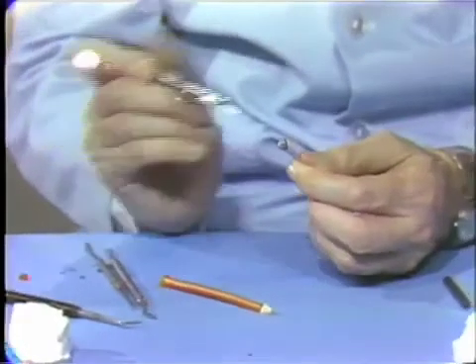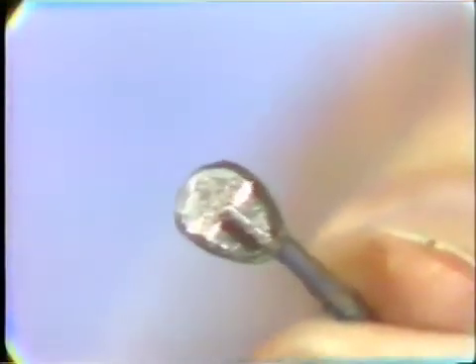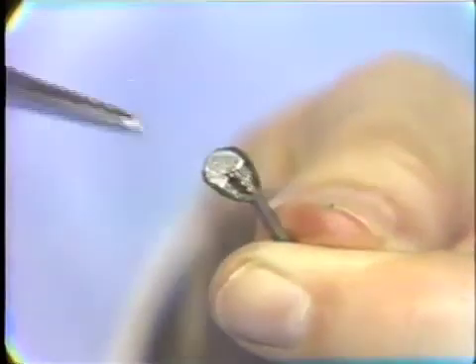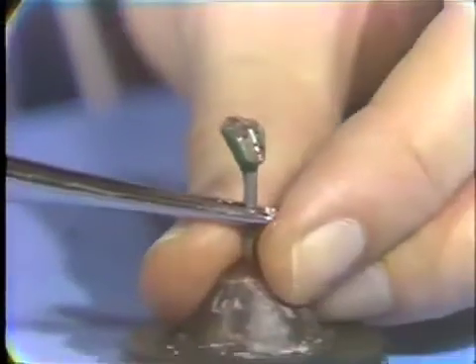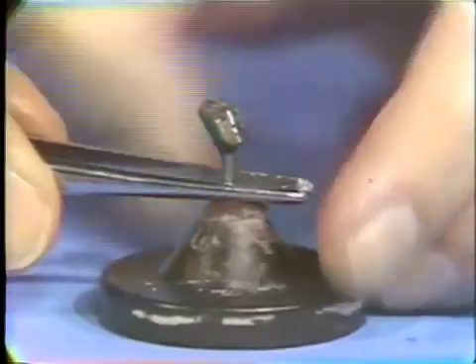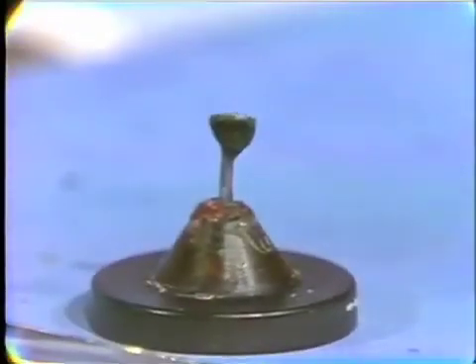You can now see the metal backing underneath with the wax occlusal on the surface. Metal backing, and then the wax occlusal. You can see too, I think, looking on the underside, the bevels that extend down on the proximal there to give good contact relations. This is mounted in a crucible former, invested and cast in the usual manner using a hard crown and bridge gold.